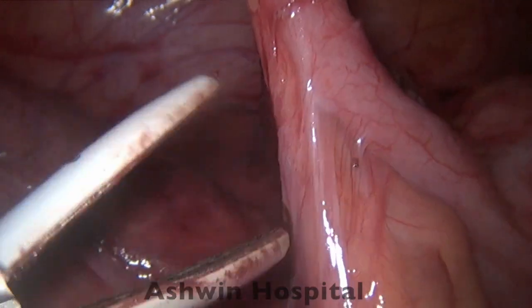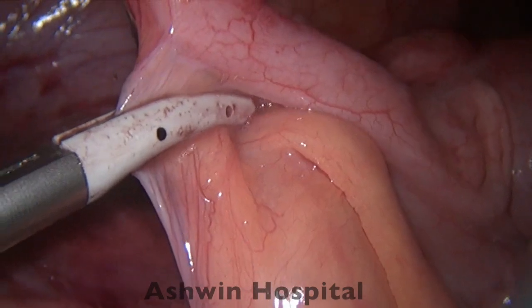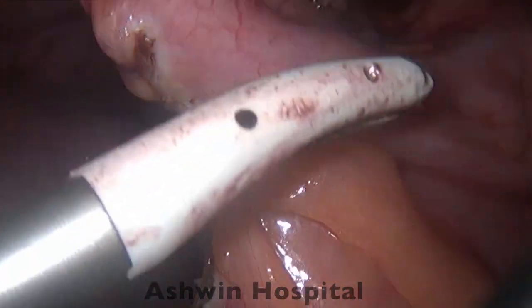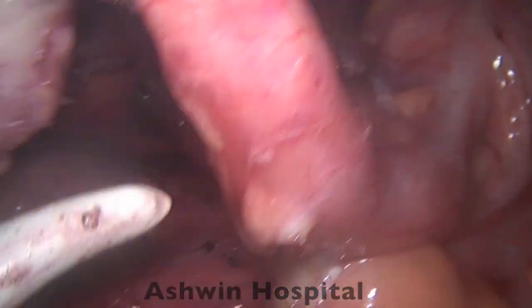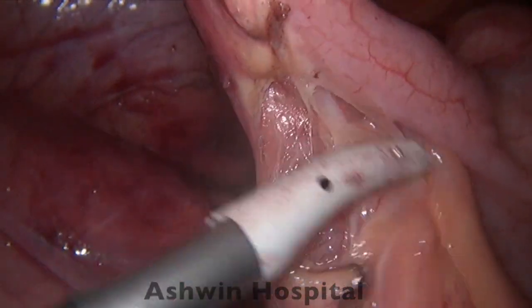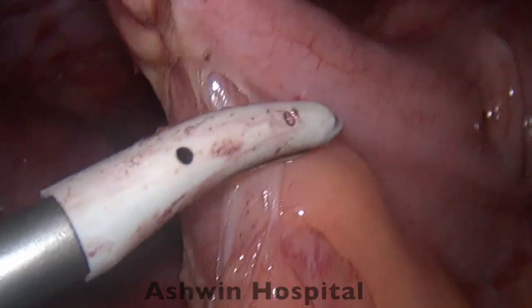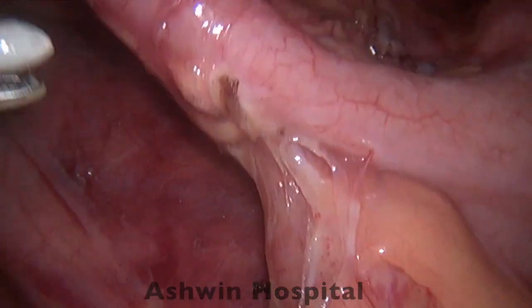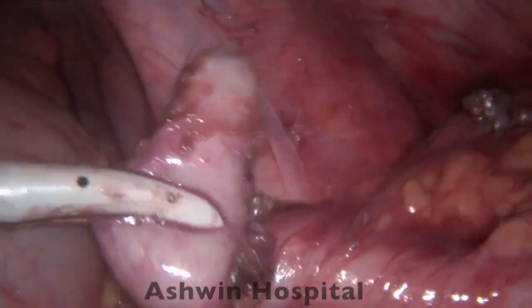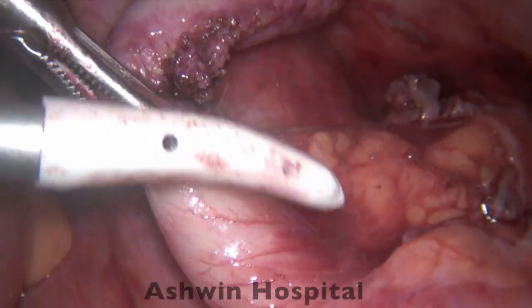Isolating the appendix means its size will be small enough to be easily brought out through a 10 mm port along with the endo loop applied distally. Leaving too much meso makes removal difficult. We confirm the cecum is clearly identified so that dissection at the level of the appendix base can be done meticulously without progressing too far. The terminal small bowel is noted very close — we do not use inadvertent cautery there, as any energy source near bowel carries high potential for thermal damage.